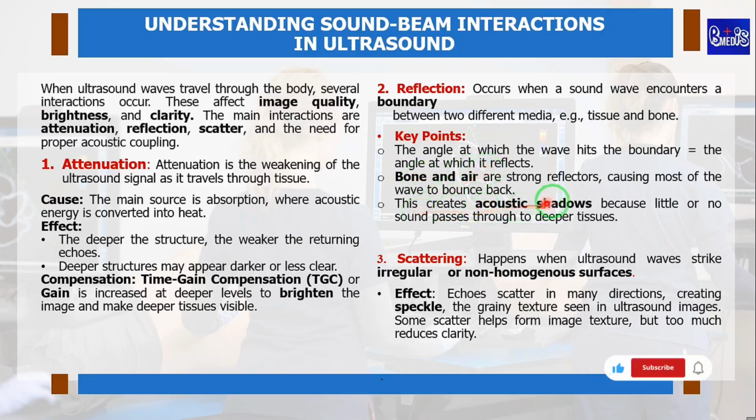This creates acoustic shadowing, which we'll see in our evaluation of artifacts. So this creates acoustic shadows because little or no sound passes through to deeper tissues. I hope that is clear by now.